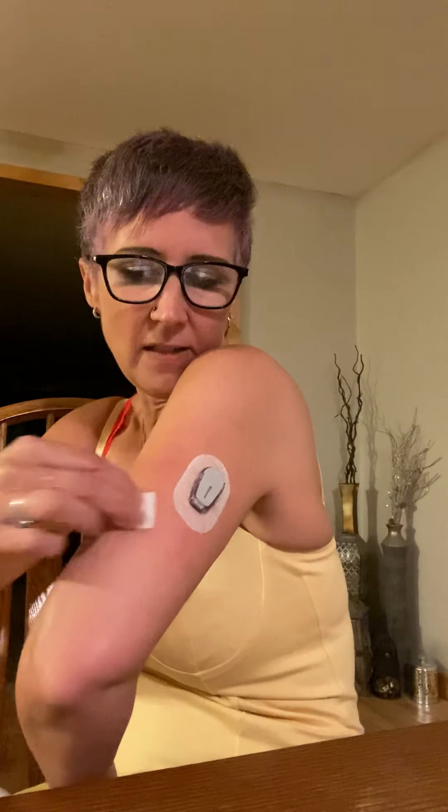Let's see — today is the 16th I believe, or 17th, so I think Monday is when I'm supposed to change my Dexcom again. So I just need this patch to last until Monday, and today is Friday, so I'm sure it will do that just fine.